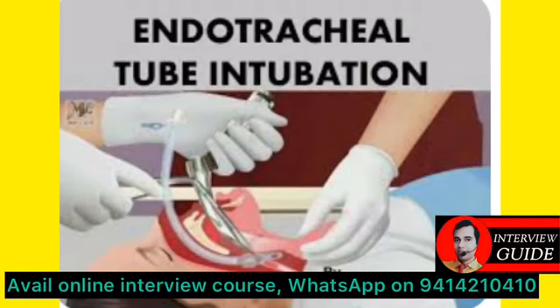Now I will explain the procedure for endotracheal intubation. First, we have to attach the patient to all the monitors. Then we open the mouth of the patient and suction all the secretions, and check for any injury to the dentition or any loose tooth. We have to assess the patient's mouth before doing the intubation.